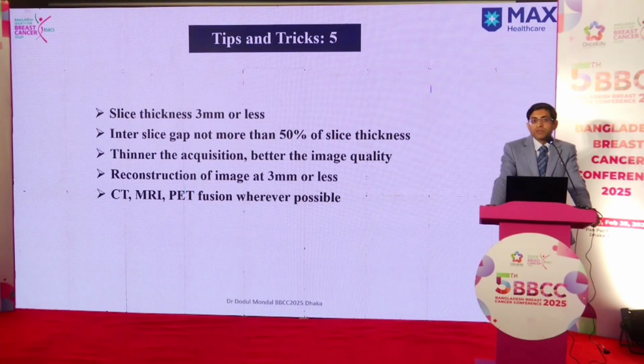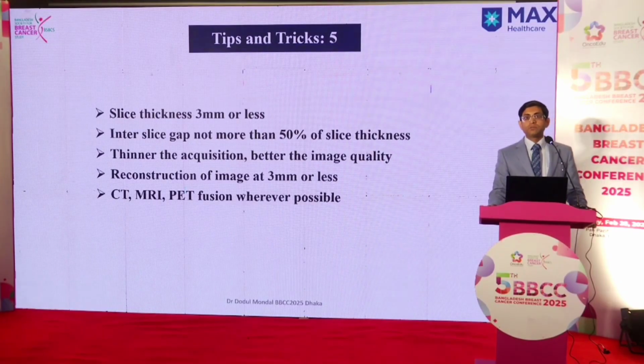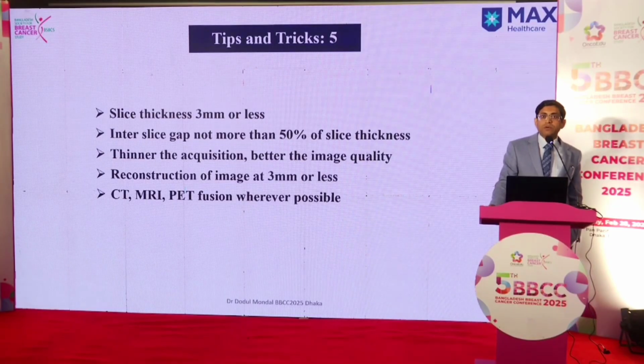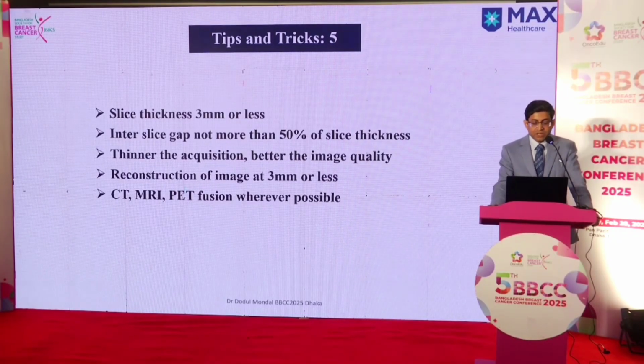Whatever kind of diagnostic images or pre-treatment images you have, like CT, MR or PET, it's a good habit to fuse all of them in your planning software. If you have registration software, it's always good to co-register all these images to have the best information about the gross tumor, the primary, and the nodes together. Sometimes it gave us information about a missed metastatic tumor as well, like there was a small lung nodule which was missed, but when we fused it, we could identify it, we went back, we discussed, and the intended treatment protocol changed. So it's very important to have a look at the pre-treatment or pre-chemotherapy imaging.